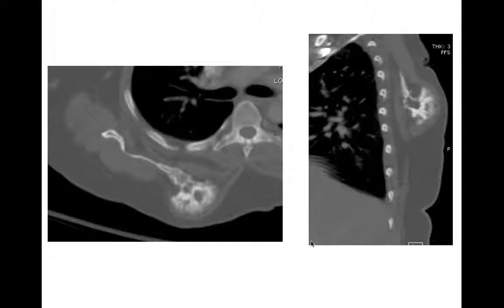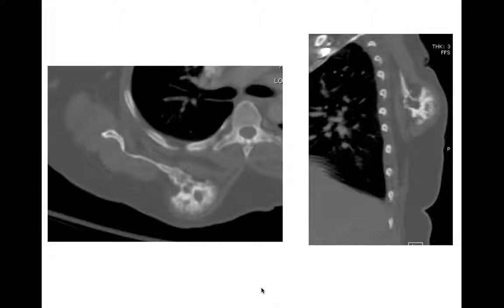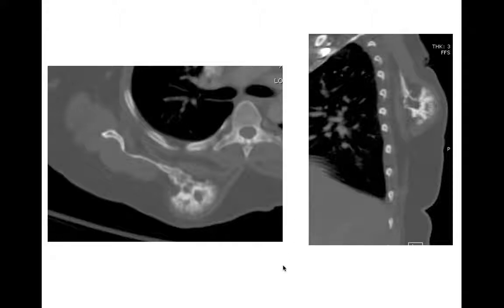Here's a pedunculated osteochondroma arising from the scapula. When describing osteochondromas, look for continuity with the cortex and underlying marrow of the bone — that helps confirm the diagnosis. On CT or MR, look for significant cartilage in the cap: once it starts to grow, particularly greater than 2 cm, you worry about malignant degeneration. This patient had multiple hereditary exostosis — more likely to undergo malignant degeneration — and centrally located ones such as those off the pelvis or scapula are more at risk. This was a perfectly benign example.